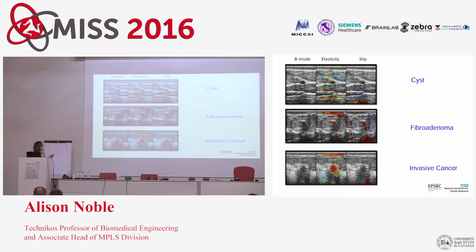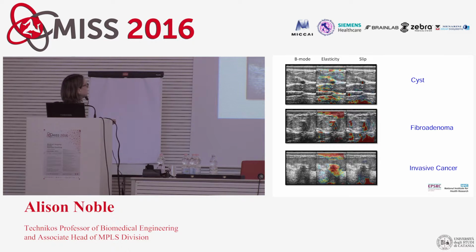They don't worry about those. They don't worry about them because they can see them. They don't worry about them because it's not a cancer. The hard ones are distinguishing these two. And if you look backwards and forward between the two, by eye you can't distinguish them. And it's for this reason that 80% of the biopsies that are done lead to the conclusion that the mass is benign, because they can't just pick out the cancers.